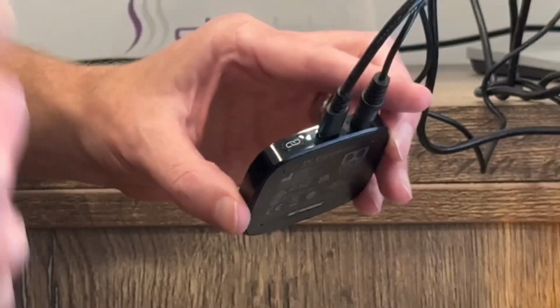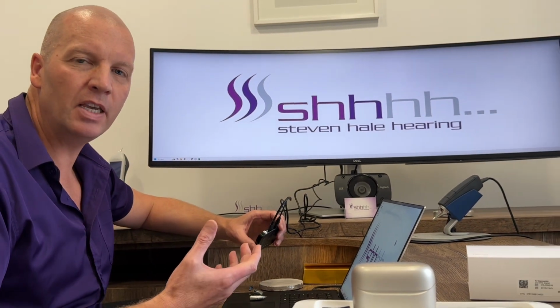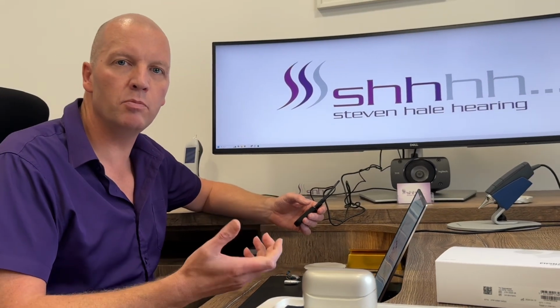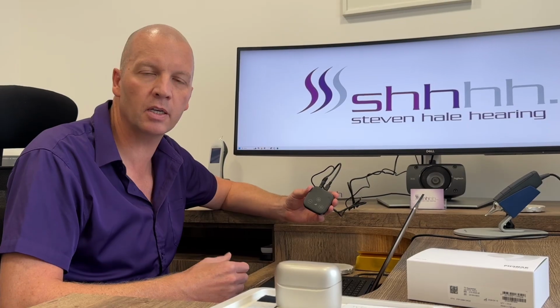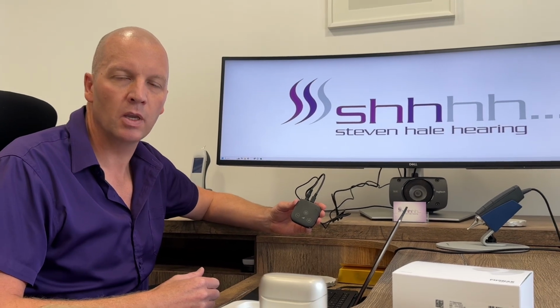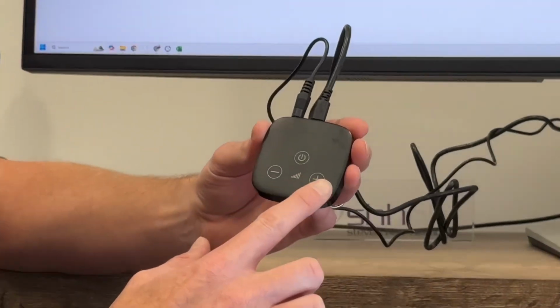Next stage is to put the TV on and listen to see if you can hear. I find it easier if you actually turn the TV down to 0. Don't mute it, because it will also mute the transmission from the TV connector. Turn the volume down to 0 on the TV and see if you're able to actually hear the TV. If it's ridiculously too loud or too quiet, you can adjust the volume on here, okay?